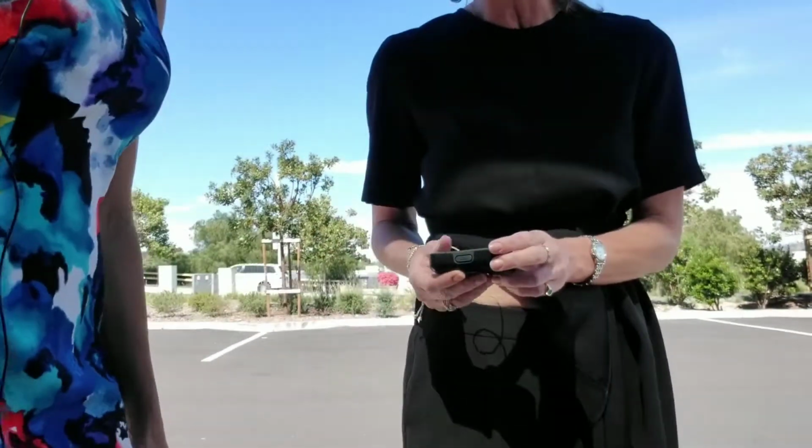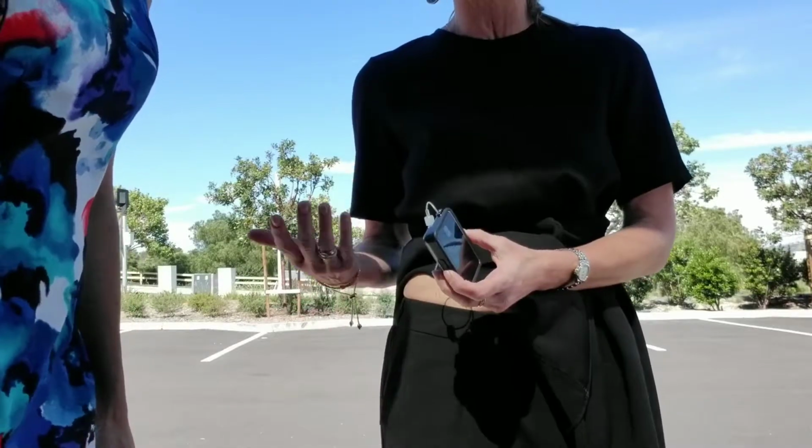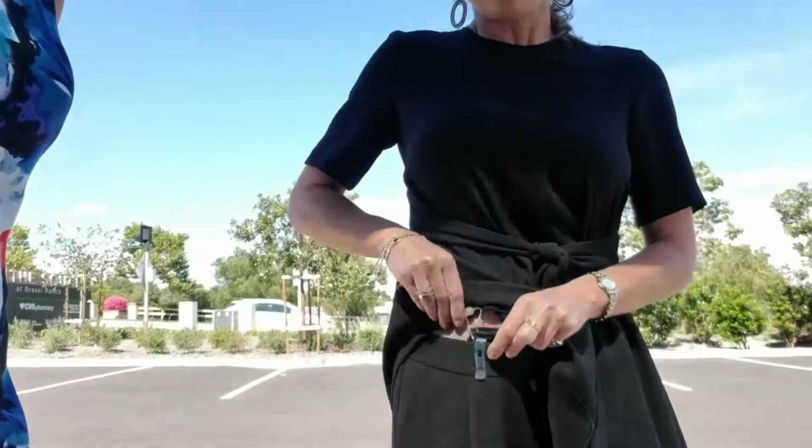Some people might worry about people seeing things and asking questions, or you just want to go about your daily life and not be interrupted. So then I would just push the pump right back into my waistband and off I go.